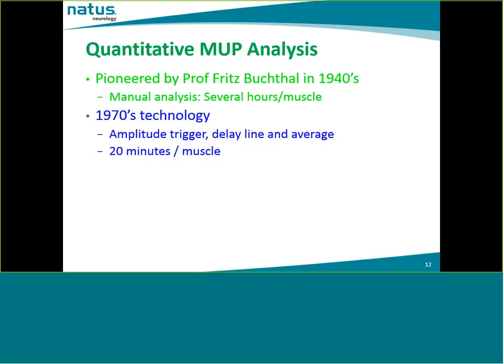Now, given the time constraints in a busy clinical EMG laboratory, that's a lot of time to spend on examining one muscle, and that has been the primary reason why many moved away from quantitative analysis. They think it's a very time-consuming process. And as we will see in this seminar, that's actually not the case.